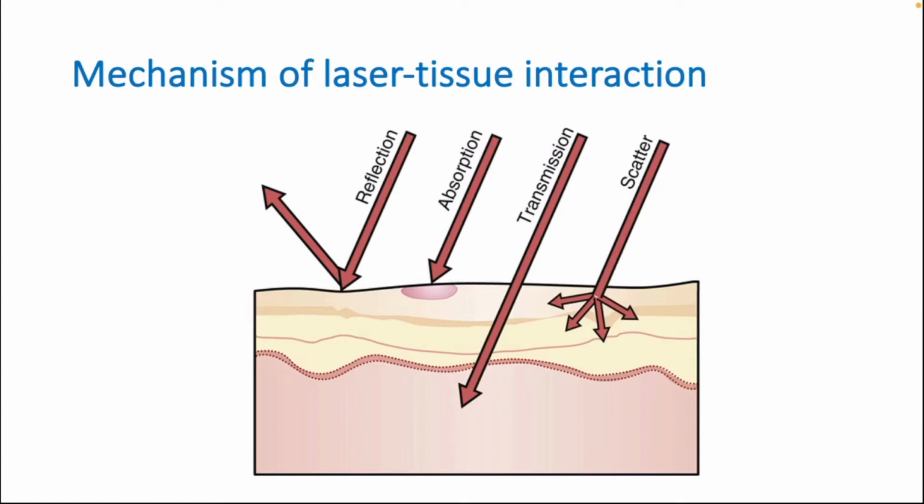As for the mechanism of laser tissue interactions, for therapeutic purposes, laser tissue interactions are mainly determined by two parameters, namely the laser exposure time on the tissue and the effective power intensity, taking into account the tissue-specific absorption.